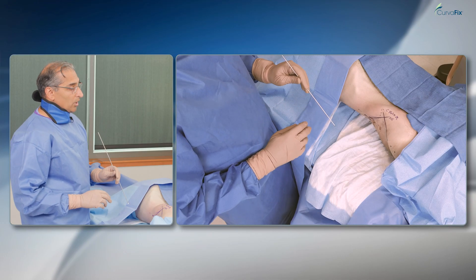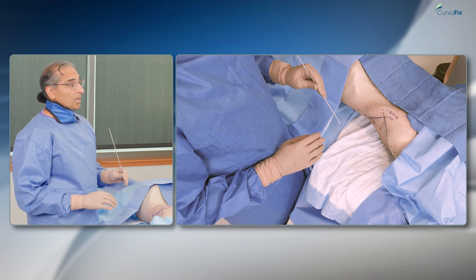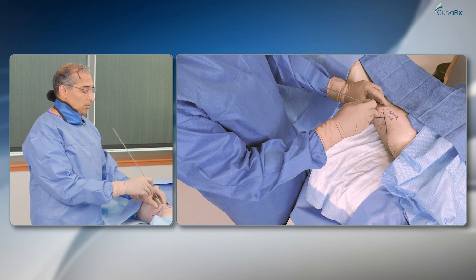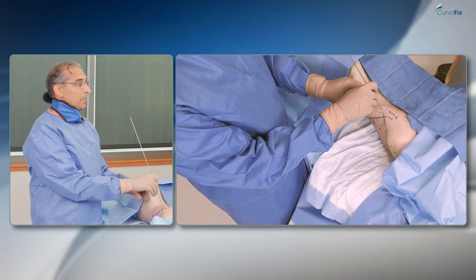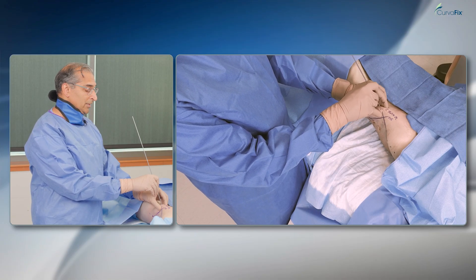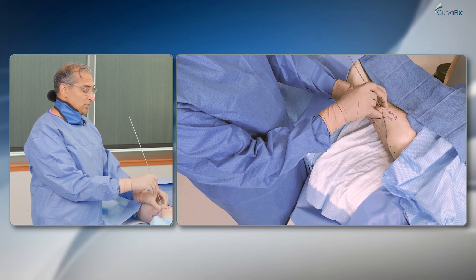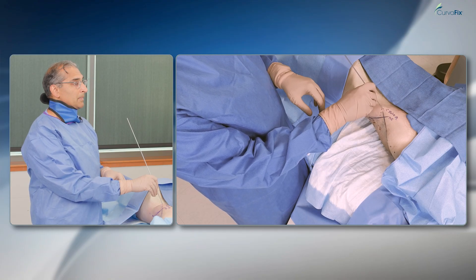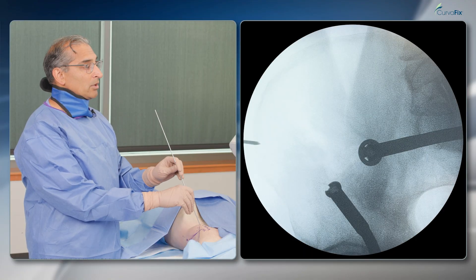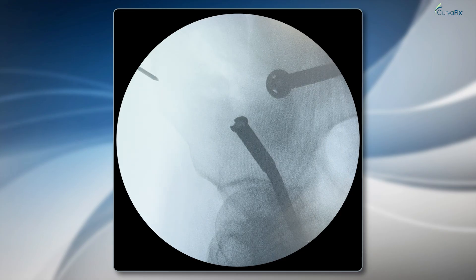To get the starting point for a posterior column screw through the antegrade fashion or through the gluteus medius pillar, you want to place your guide wire onto the pelvis between the inner and outer table. On a thin patient you can sometimes palpate both tables. You want the wire in between the two tables and pointing or aiming towards the posterior column — headed to the posterior column and posterior to the acetabulum.